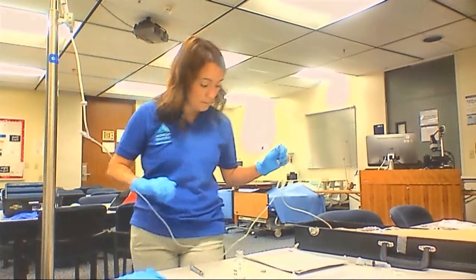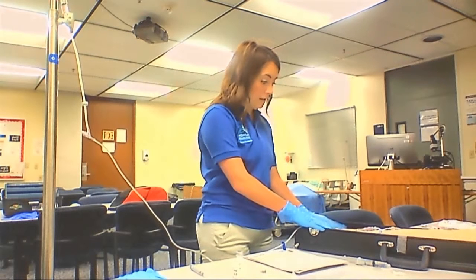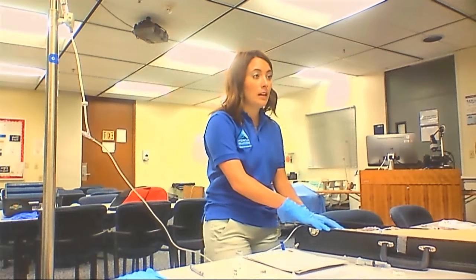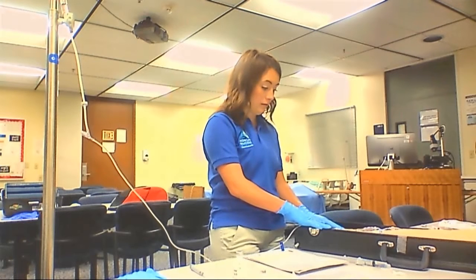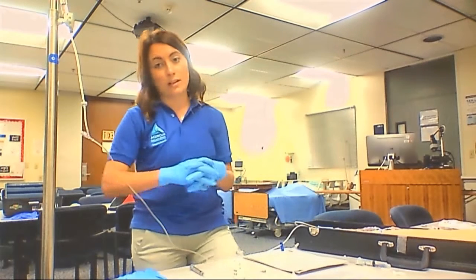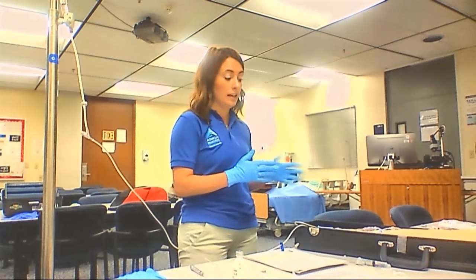All right. Now, I've established my flow rate, and now I can watch and observe for signs of infiltration, inflammation, any pain that the patient may be having at this point, and apply a new sterile needleless device for administration of the next medication. I'll dispose of any needles and syringes that I have into the sharps container, and then I will monitor the patient again for any swelling, redness, erythema, any adverse effects of the antibiotic being infused.